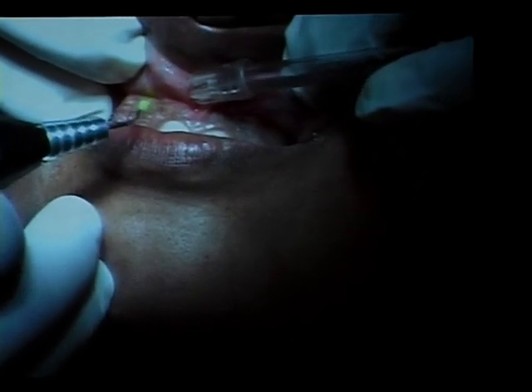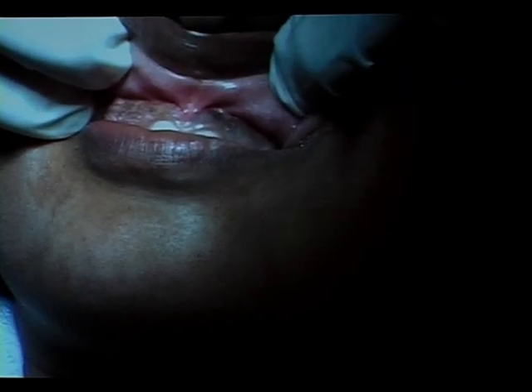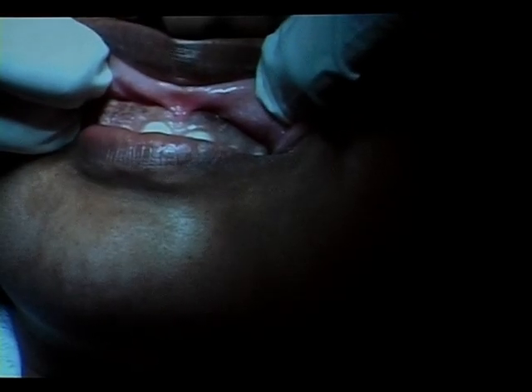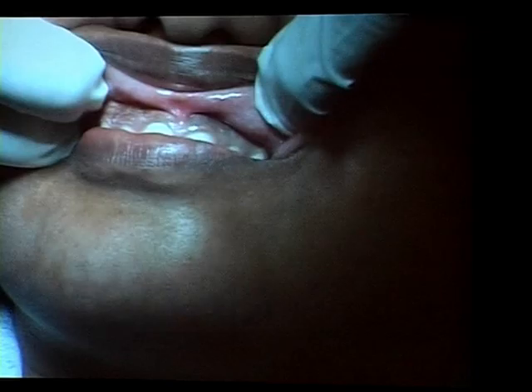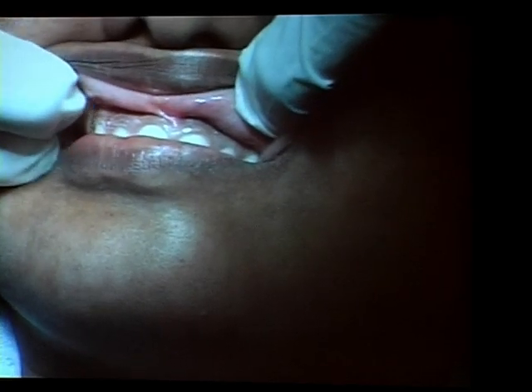So of course, even now, we can see that there's much more lightening of that area than on the other side. Can you just increase it a little bit? Wattage. I think effectively you need about 0.8 to 1 watt, Ralph. It's 0.7 average, okay.